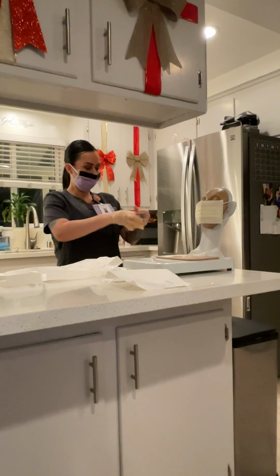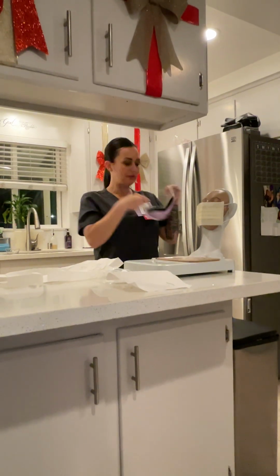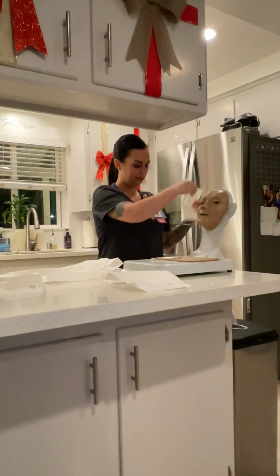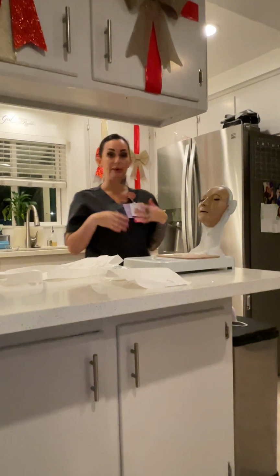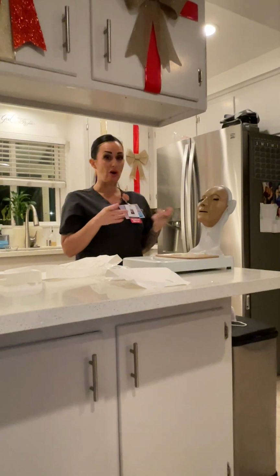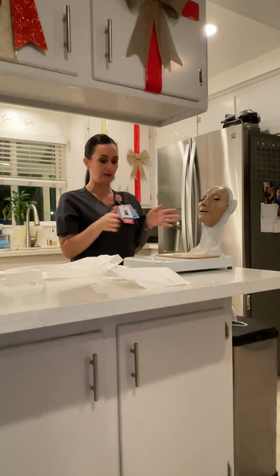All right. And then from here, now we are going to be discarding our gloves. We're going to get rid of those. We're going to want to remove my mask. We want to remove our patient's mask. We want to make sure that our patient is comfortable. We want to make sure that the bed is low, locked, and the call light within their reach. We're going to also perform our hand hygiene, and we're going to document our procedure.